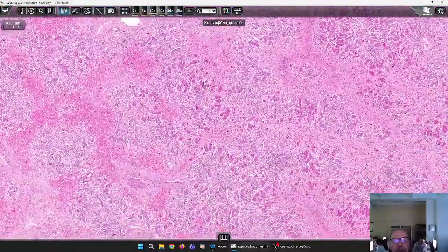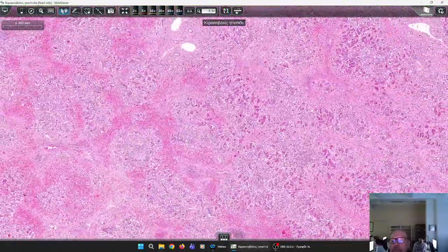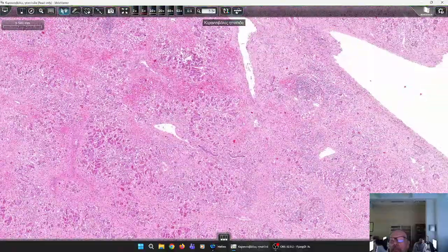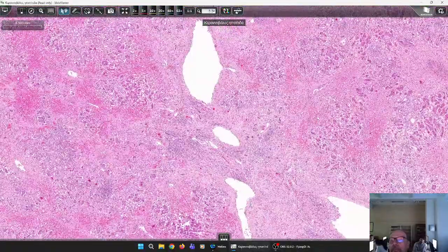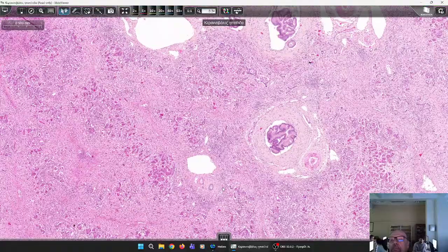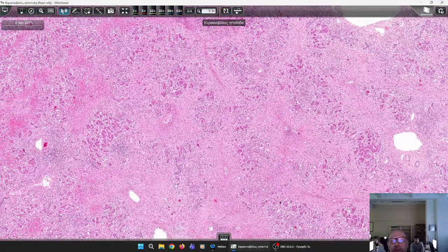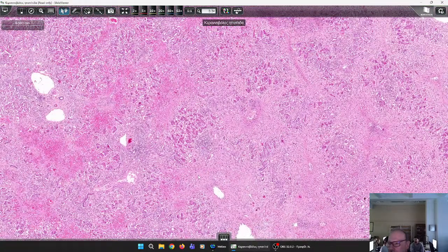I have actually seen an explant, a whole liver specimen, from a woman that took acetaminophen, and there was no hepatocyte inside. We couldn't identify a single hepatocyte. And is all this called necrosis? Yes, it's a type of necrosis. There are dead hepatocytes. You can see that you have massive liver necrosis.